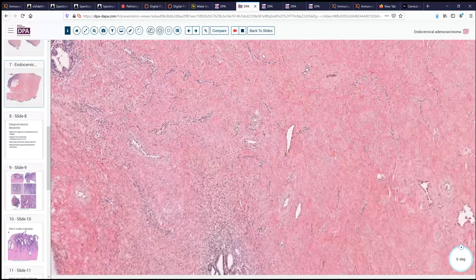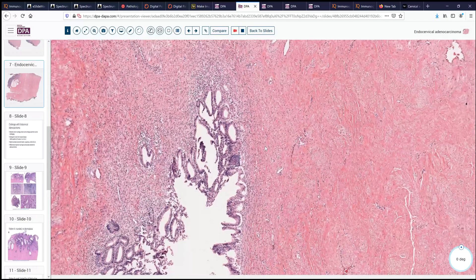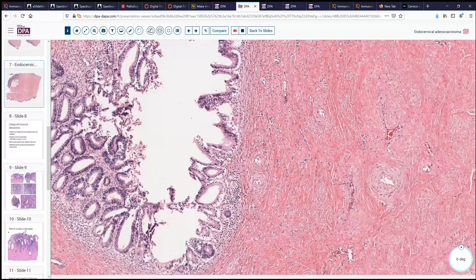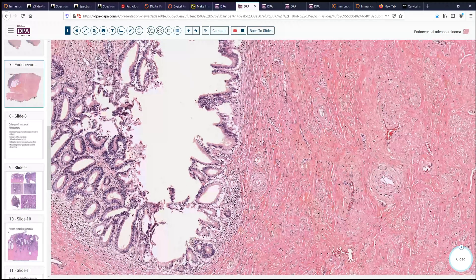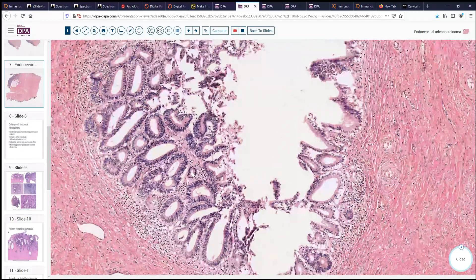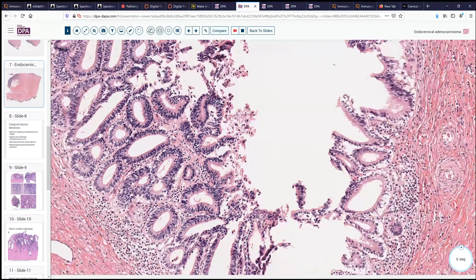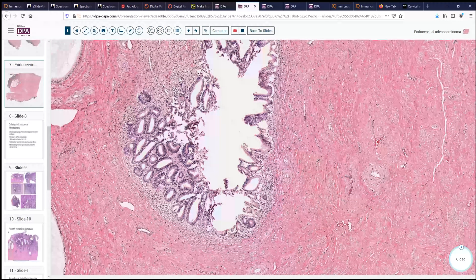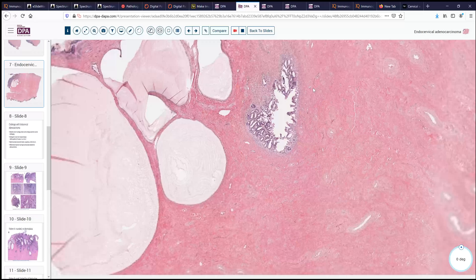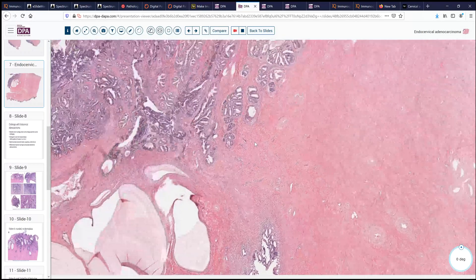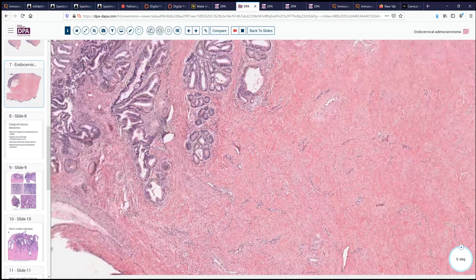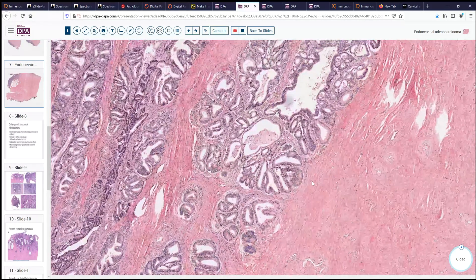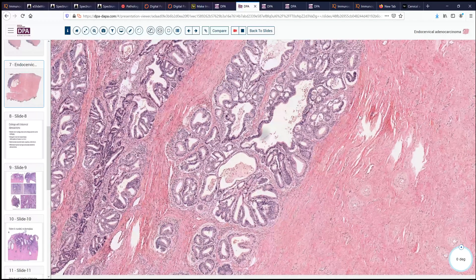Looking here at this other area, we again see endocervical glands fairly well differentiated in this location with some preservation. But as we look over here, we see there is hyperchromasia — these nuclei are much too dark, much too crowded — but we're not really seeing any destructive invasion, just a tad bit of inflammation. Based on our findings, we really just see these one or maybe two small areas of little glands streaking off into the stroma.